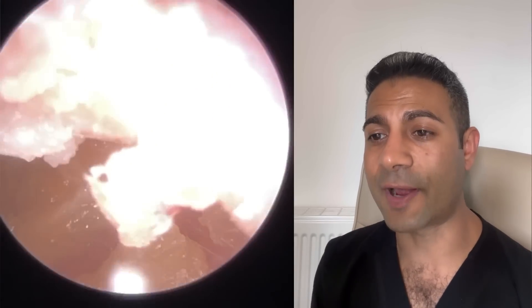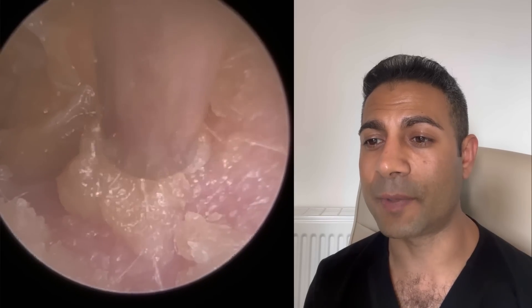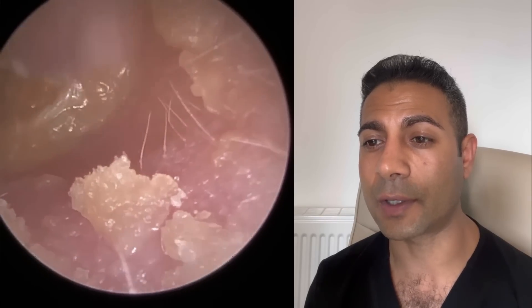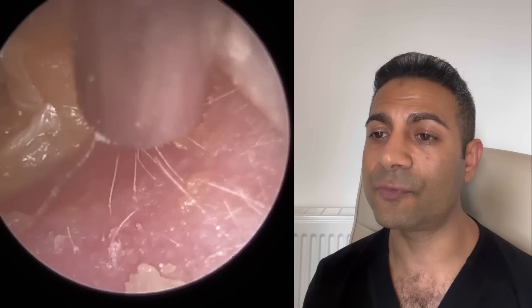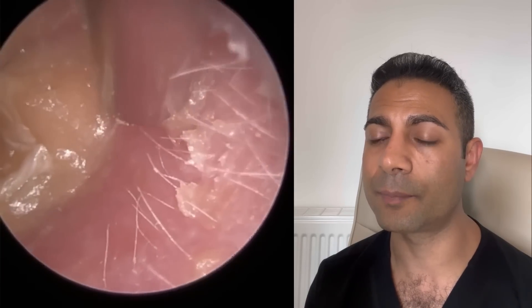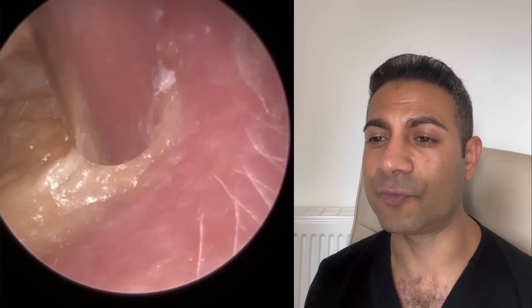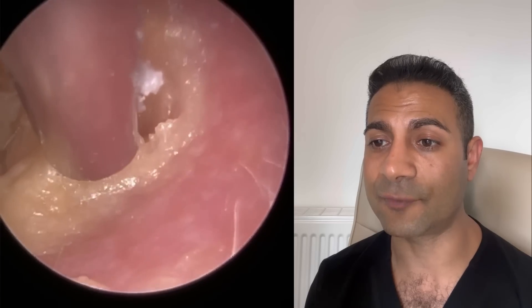Hi everyone, this is Neil Reiteter, Consultant Audiologist and Director of Clearwax. Thank you for joining me in my latest video using the iClearScope Endoscope. This is the sequel to yesterday's procedure where a patient attended with bilateral bacterial otitis externa. I showed you their right ear procedure yesterday and this is their left ear today.